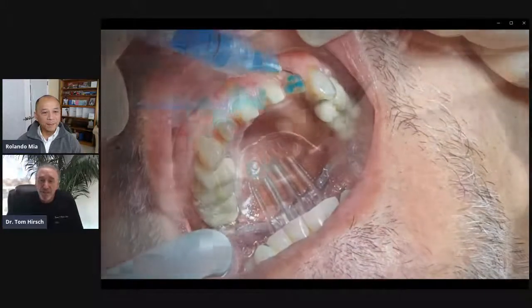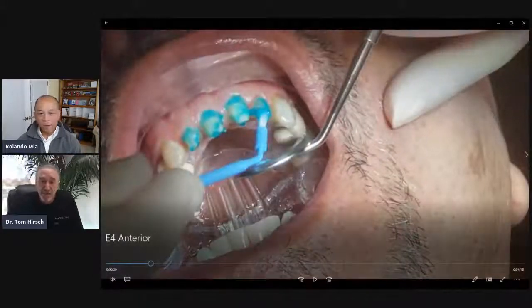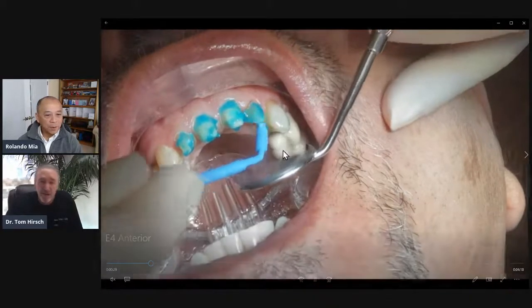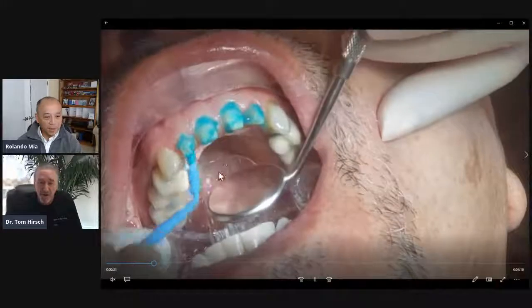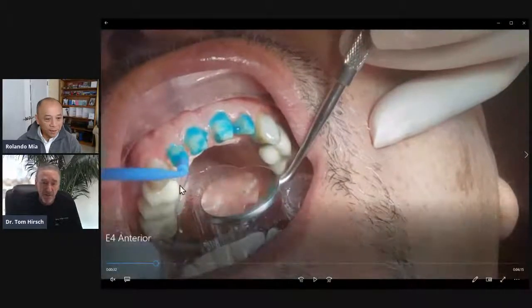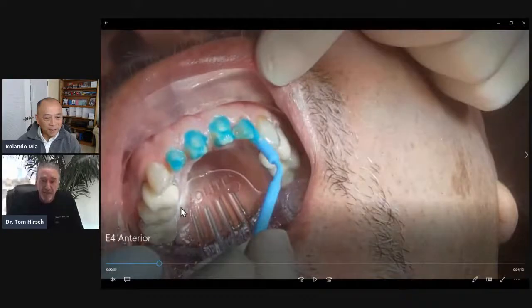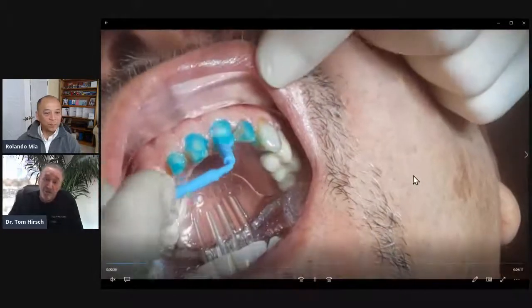If you look, Rolando — can you point things out on the inside of the mouth? Show them the tongue retractor and the throat protector on the back part there. Right behind my mirror. As soon as I get my mirror out of the way, there's something that, in case you drop anything, it's going to go right up against that. It's not going down the throat, which is really cool.